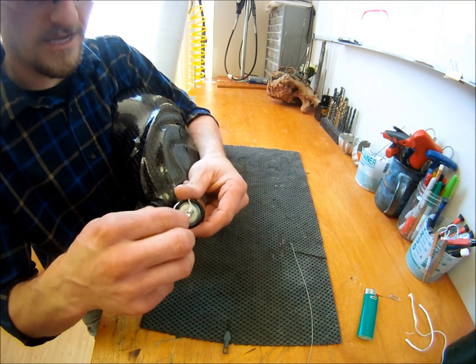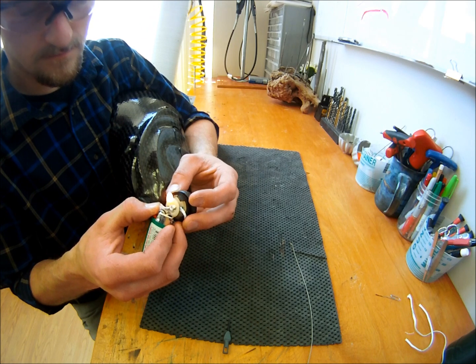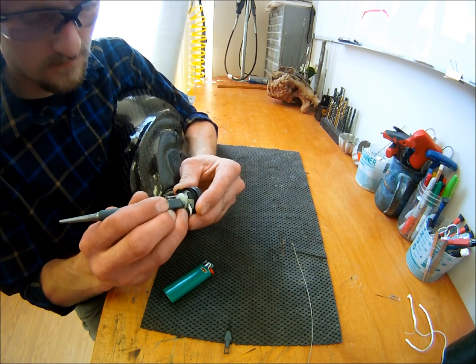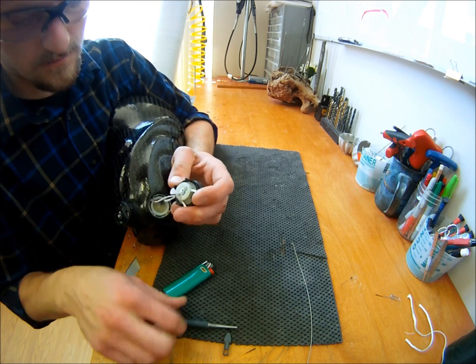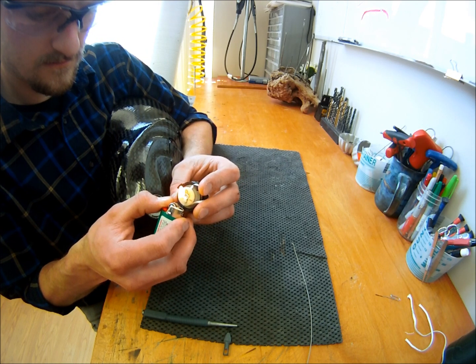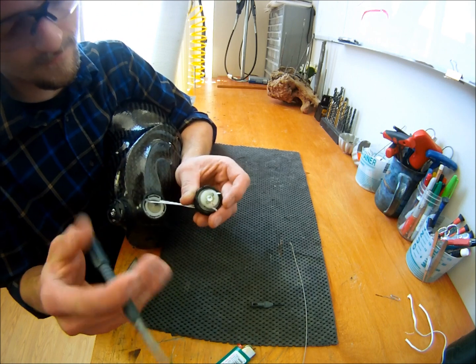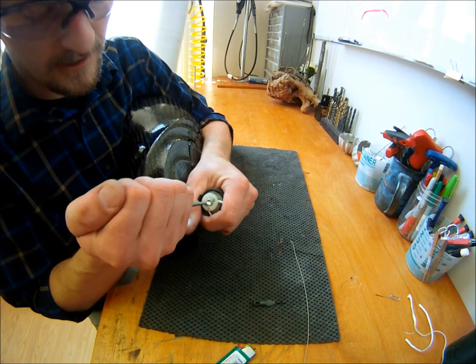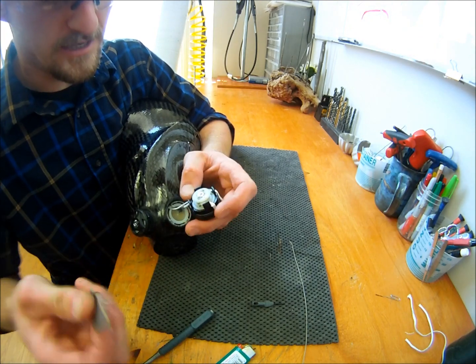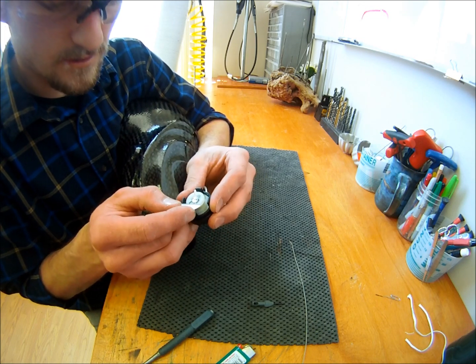Now you'll have the little tails hanging off the end here. I like to get rid of them with the lighter. And smash it down flush. At this point, I'll give it one last little push, make sure everything's in the recess. Take a razor blade or something similar and cut off the small pieces of melted spectra that may be left behind.